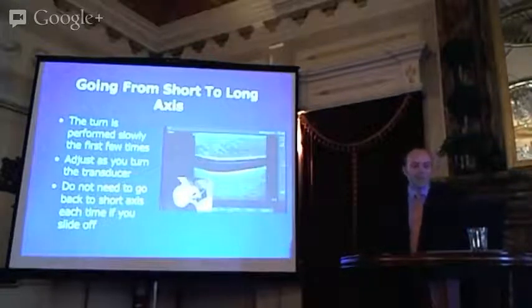That is a beautiful view. You should be able to handle that fairly easily. As opposed to the cross-sectional image, you're now looking at long axis, and this has some inherent pitfalls. You're not looking over here, you're not looking over there, and that's how you can lose your needle. The beauty is, you can lose your needle, but you shouldn't be fooled if you're looking at the tip, like you can be in short axis and be looking at the shaft.